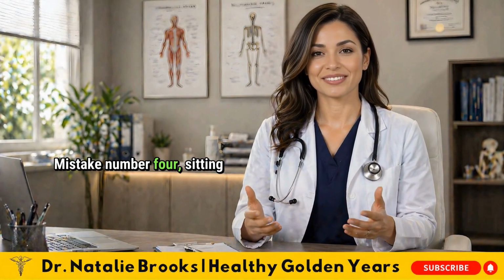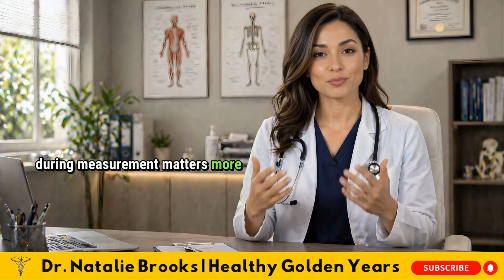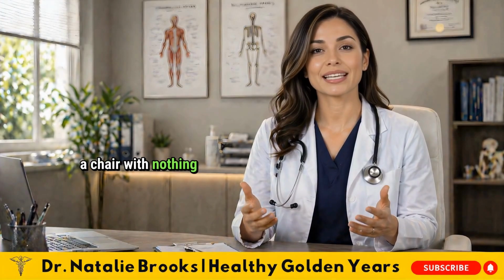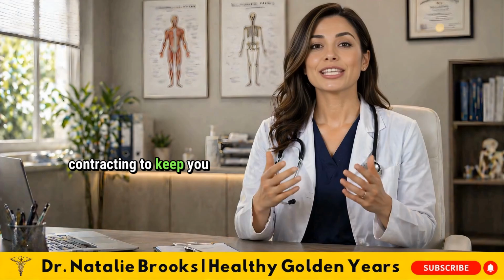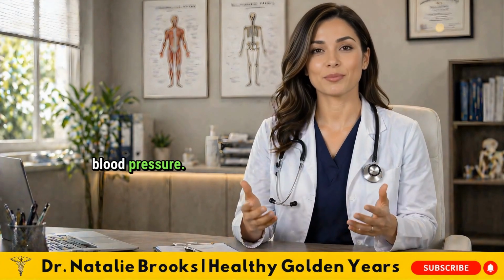Mistake number 4, sitting with an unsupported back. The way you sit during measurement matters more than most people realize. If you are sitting on the edge of a chair with nothing supporting your back, your core muscles are actively contracting to keep you upright. This mild physical tension is enough to raise blood pressure.